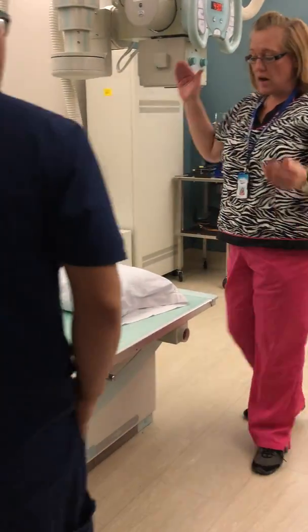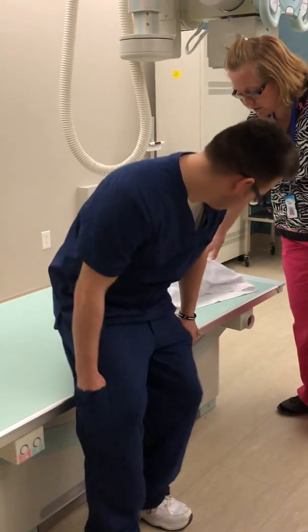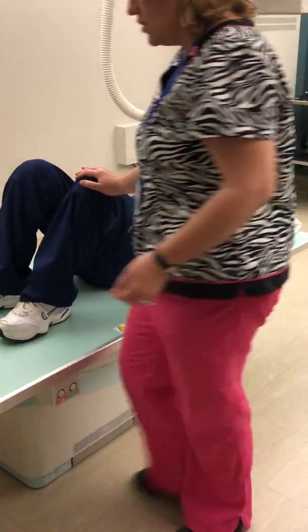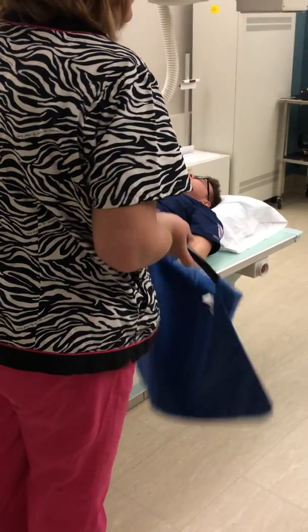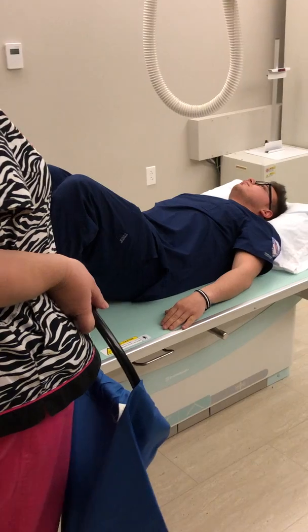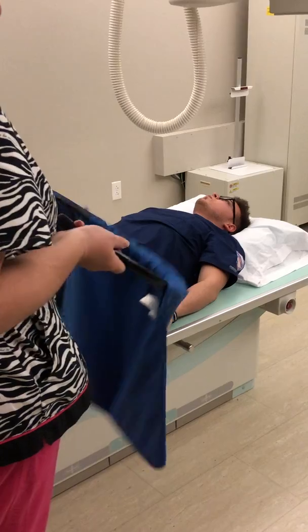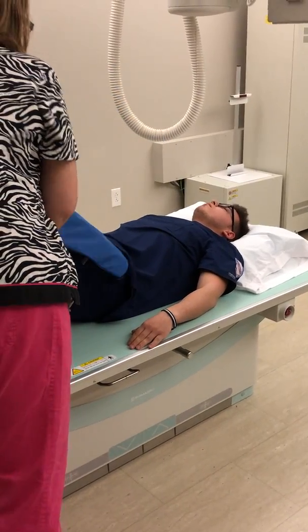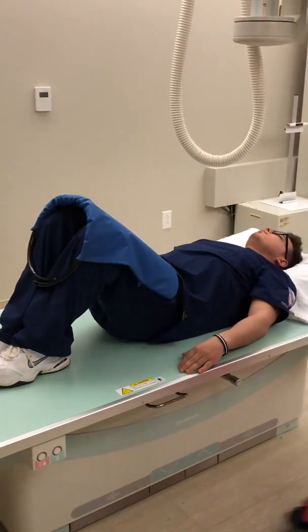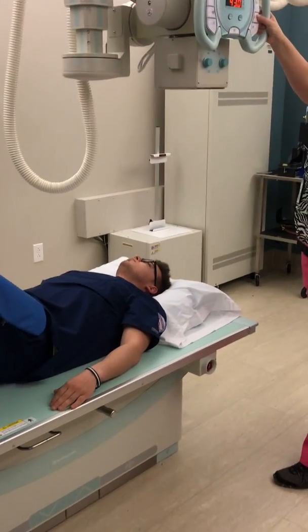All right, now I already have my SID set, have my marker in place. I'm going to have you lie down on your back with your head up here at the pillow. Okay, knees are already bent like a good patient, and if he didn't do that automatically, I could tell him that he could bend his knees and hips for comfort. I could add some support if the patient required. For a male patient, we can still shield the gonads, and so I'm just going to place it right there. I've already set my SID, but I have not set to detent the tube.